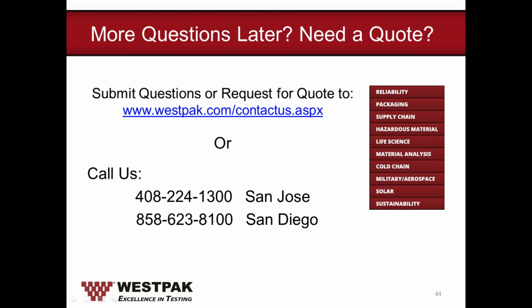Great, thanks, Katie. Next question, if you also had a sealed plastic bag with your product inside, not for sterilization, but for avoiding contamination, are you required to do a bubble emission testing, or can you visually inspect only? If that sealed plastic bag is not your sterile barrier package, then you don't need to do bubble testing. A visual will be adequate.